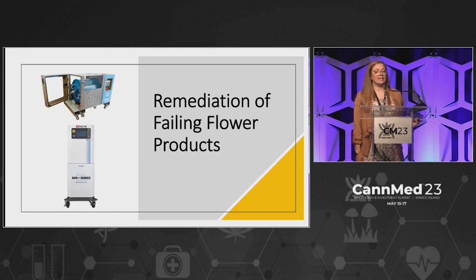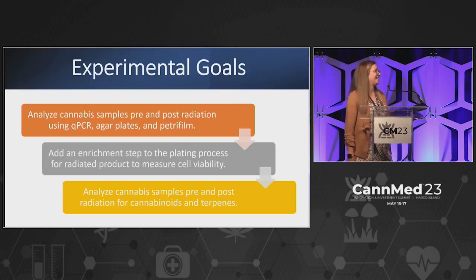We see people doing this, and as a laboratory who runs qPCR primarily, people remediate their product and it still fails. And they're not happy. They said, I killed all of the yeast and mold. And I said, well, I still see the yeast and mold. And they said, well, switch to plating. So we said, we'll look into it. And that is where this study came about.